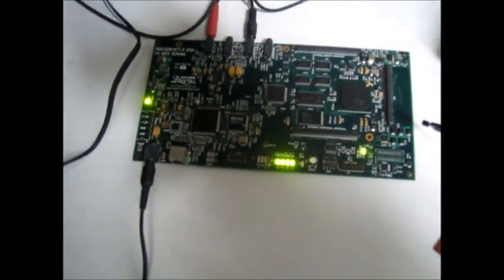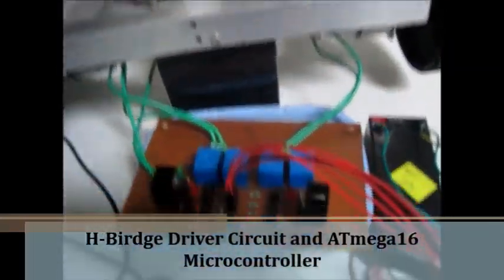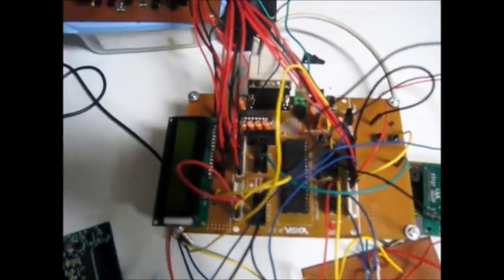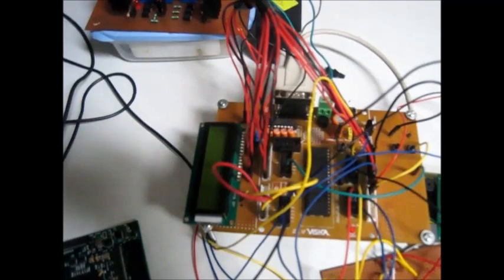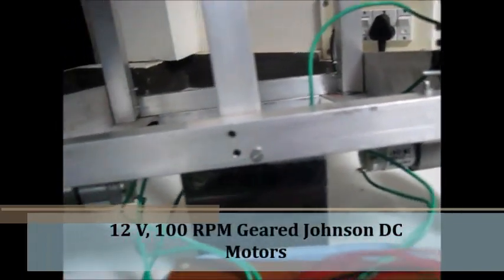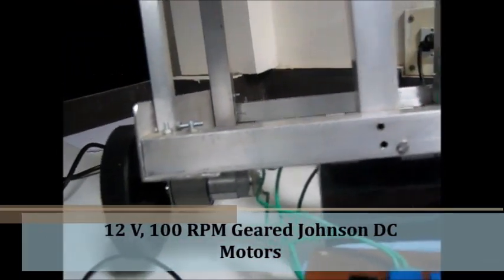To drive the motors of the wheelchair, we have used an H-bridge circuit which is controlled via the ATmega16 microcontroller unit, which is designed by us. The motors used in the wheelchair are 12 volt 100 rpm geared Johnson motors suitable to bear a torque of up to 10 kg-cm.